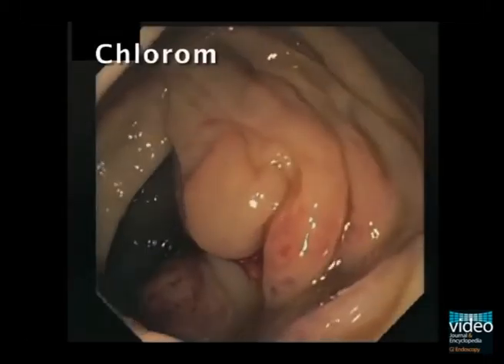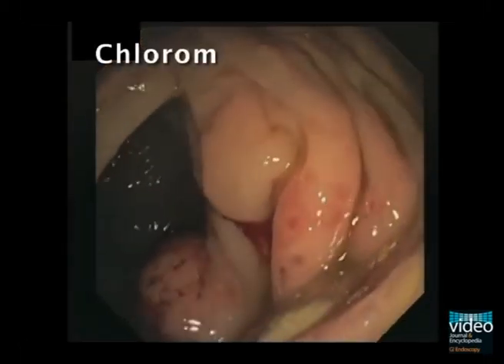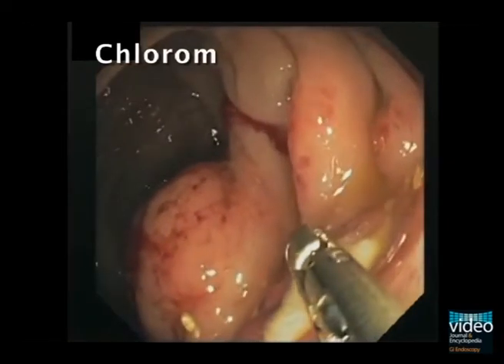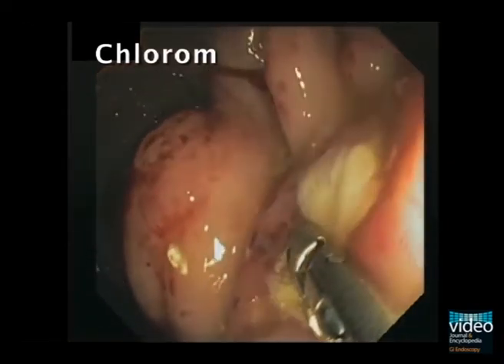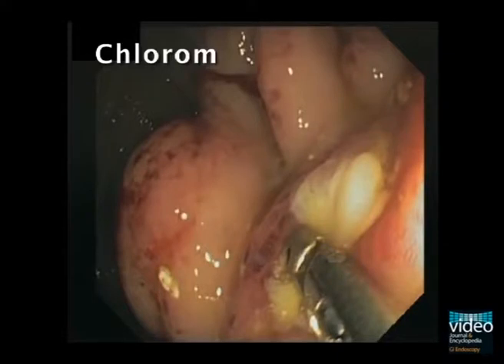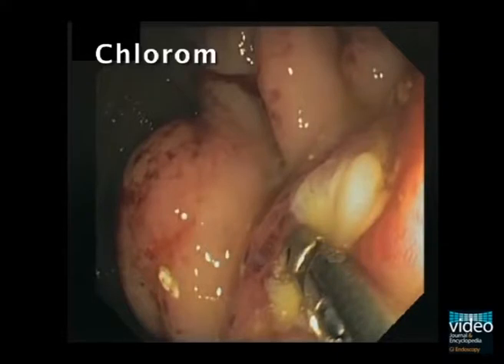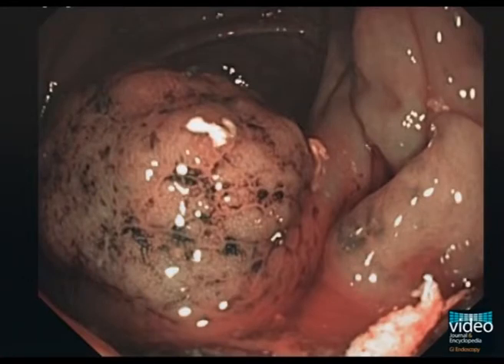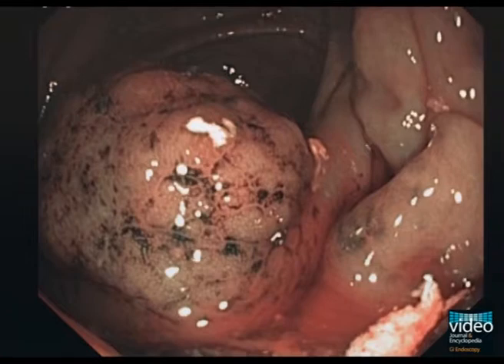Colonoscopy revealed a round tumour 6 cm in diameter in the ascending colon involving the ileum. An endoscopic biopsy was performed. Virtual chromoendoscopy using narrowband imaging did not show any adenoma-like signs (Figure A).